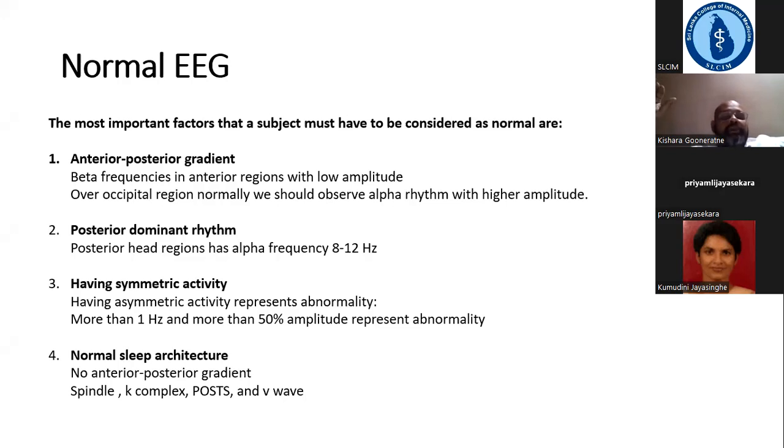And if there is a change in frequency of more than 1 hertz between both the hemispheres, that is considered abnormal or asymmetric. And of course, the patient generally during a 20 to 30 minute EEG recording should go into normal sleep.